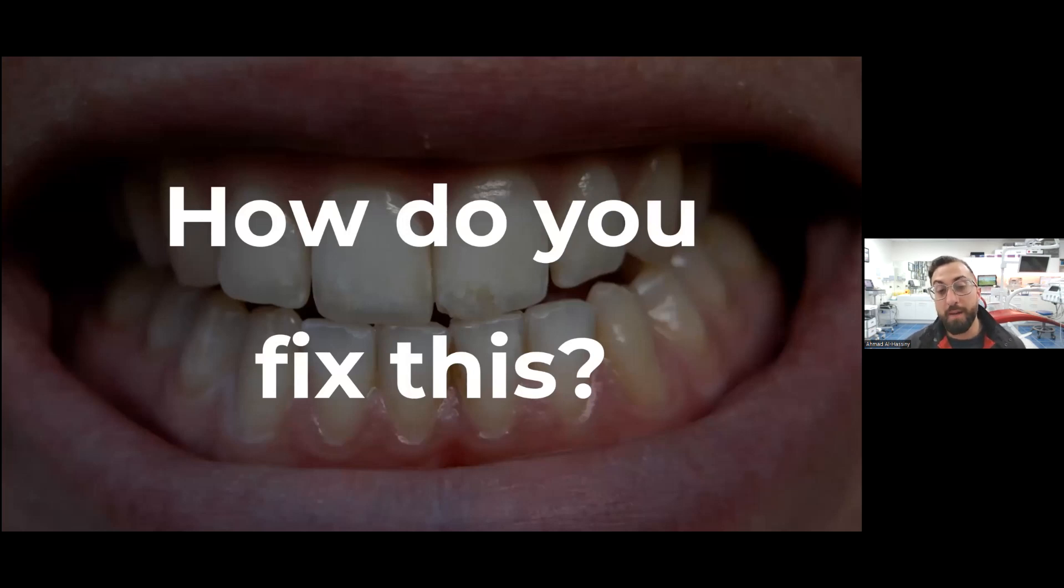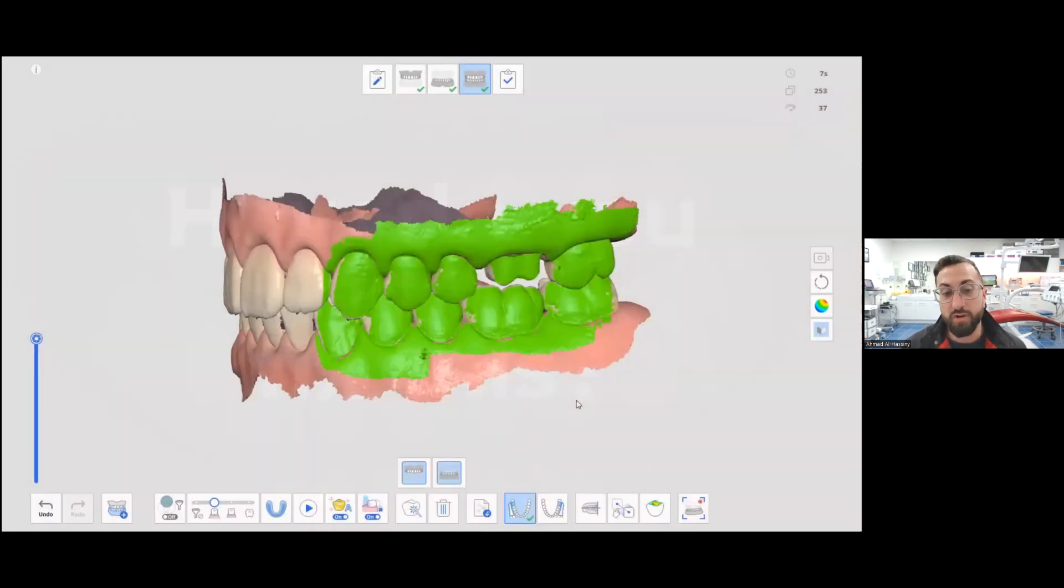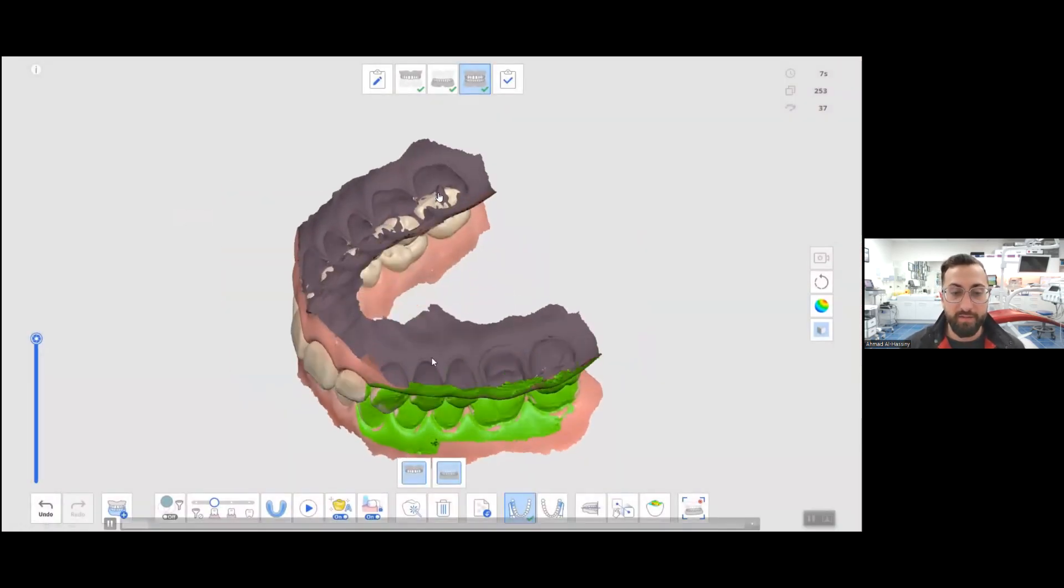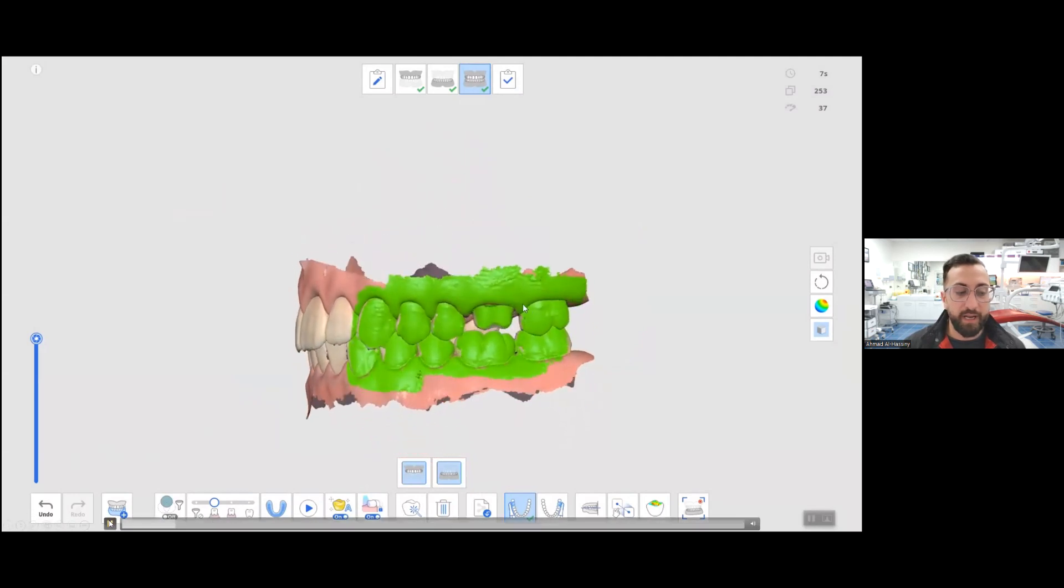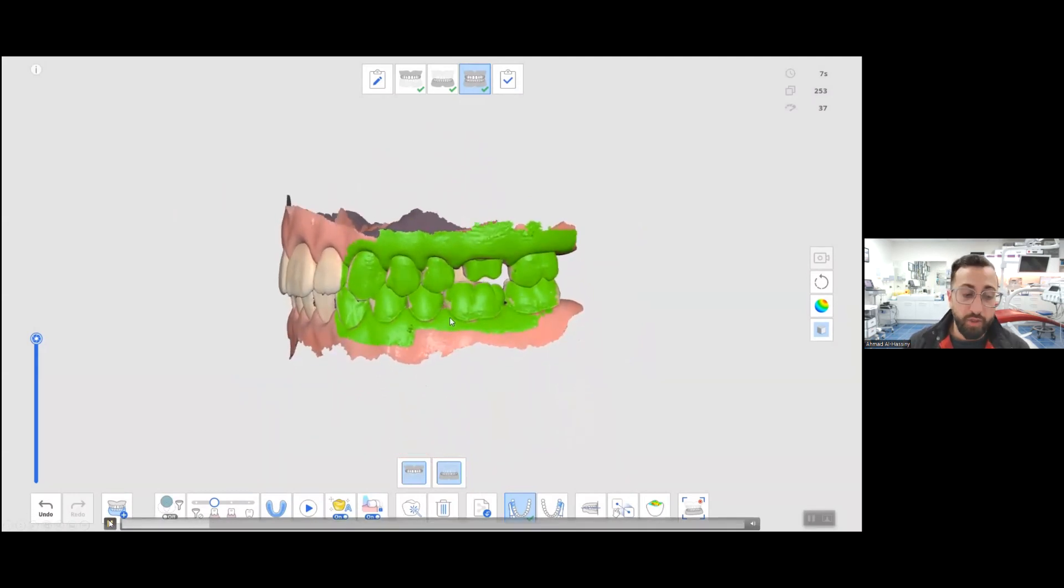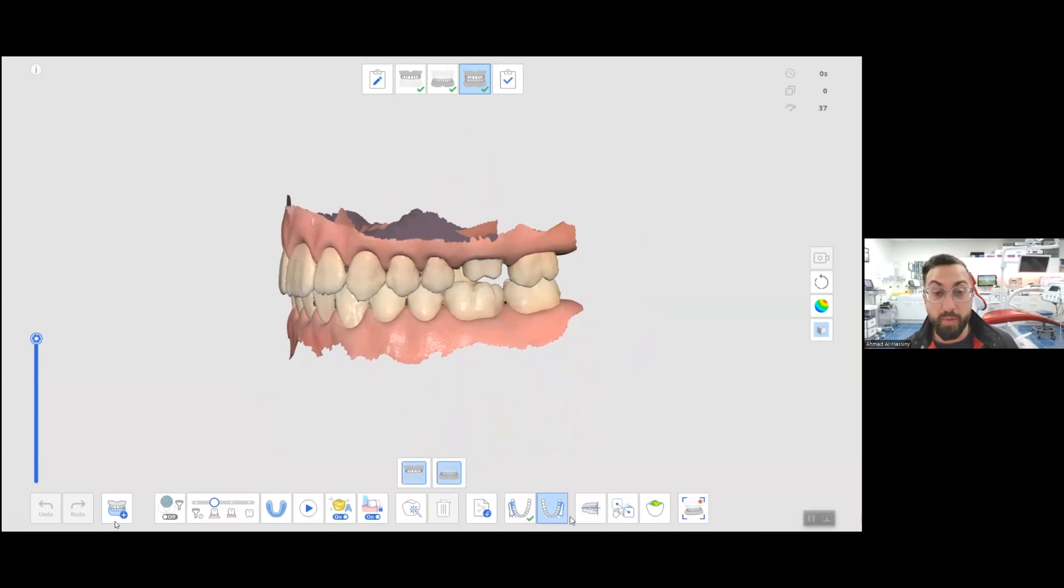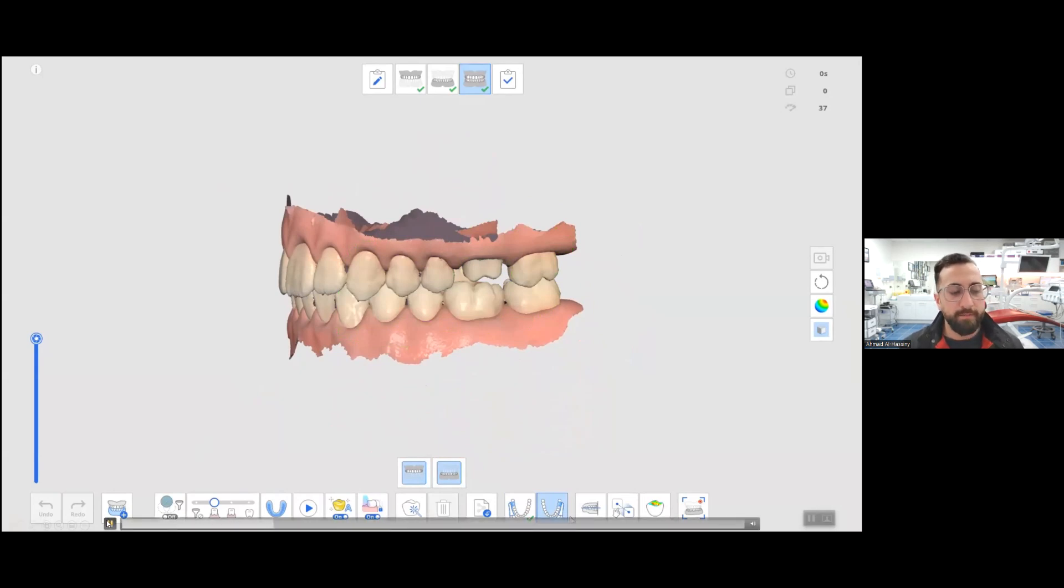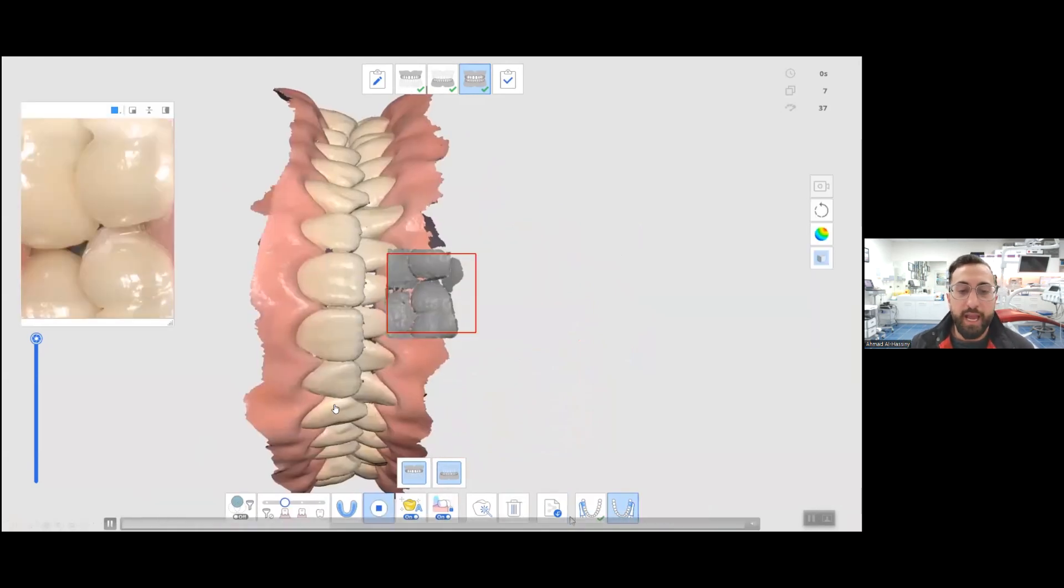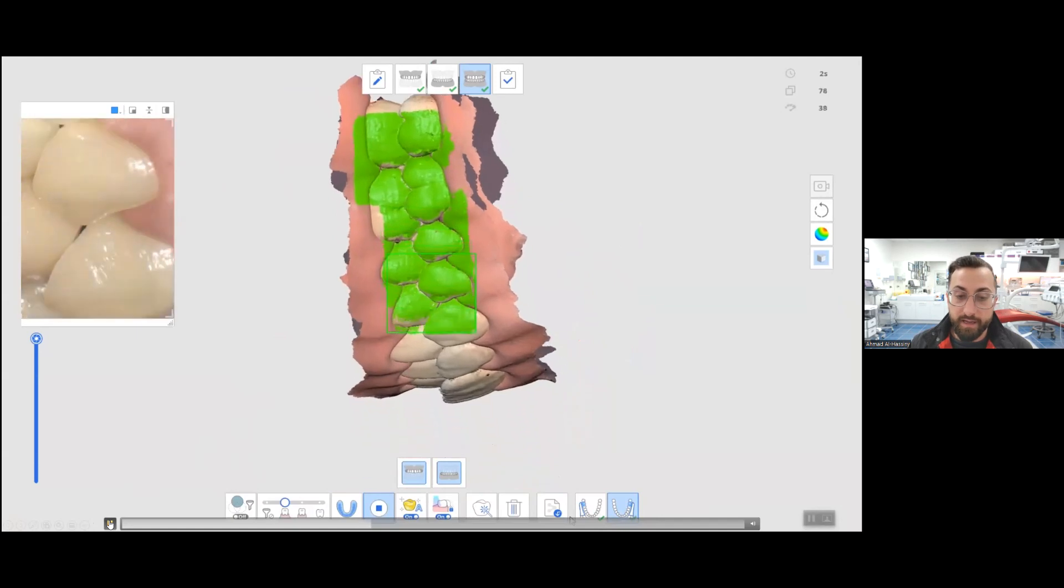In my books, the first thing I would do is take bilateral bite scans. I'll show you this very clearly. So you can see we have this very clear intersection here. And we took a bite scan on one side, as you can clearly see. The good thing about the Medit software is that it allows you to capture multiple bites, two off the bat, as you can see down there, but you can add as many bites as you really want up to, I believe, four or five.